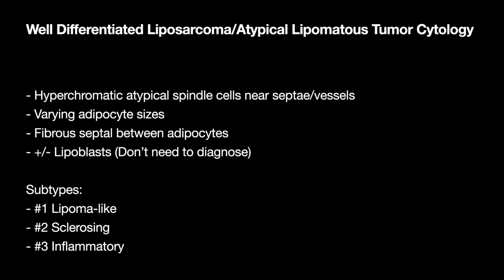And of note, if you do diagnose liposarcoma on a resection, not necessarily a biopsy, because you have the whole field of view, it's good to know that there are subtypes of liposarcomas. You have the lipoma-like, you have the sclerosing, and you have the inflammatory.